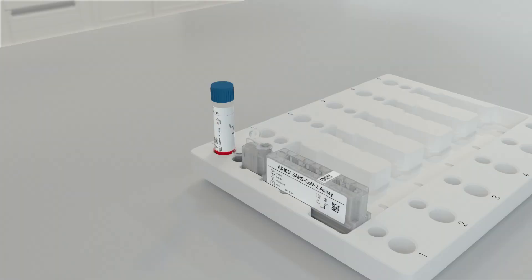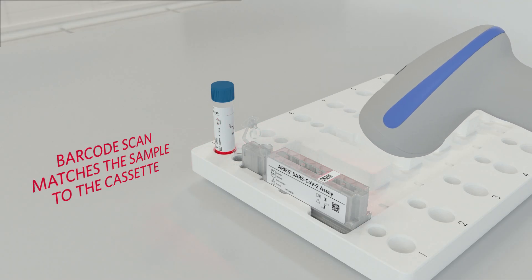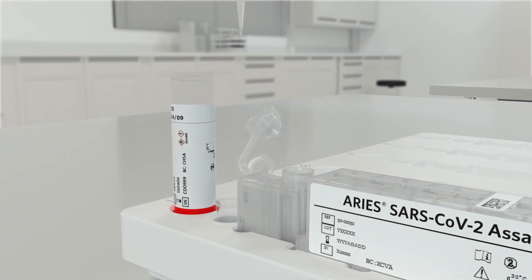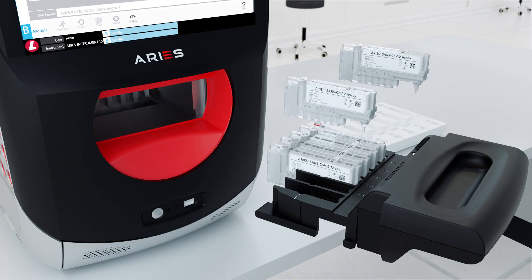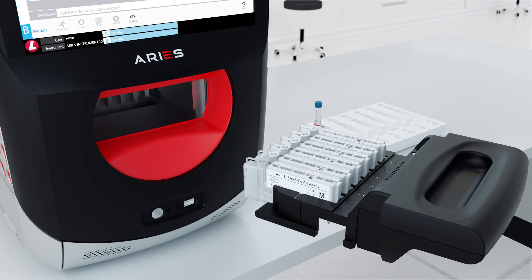The steps to run the ARIES SARS-CoV-2 assay are simple. To begin, scan the sample tube and the ARIES cassette barcodes, which matches the sample to the cassette. Next, pipette the sample into the cassette and close the cap. Then place the cassette into the magazine and insert the magazine into the ARIES system.